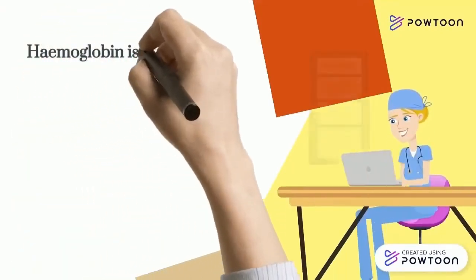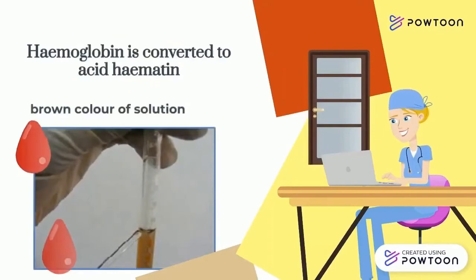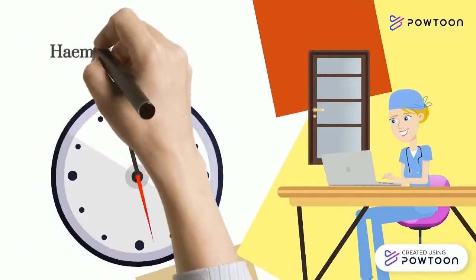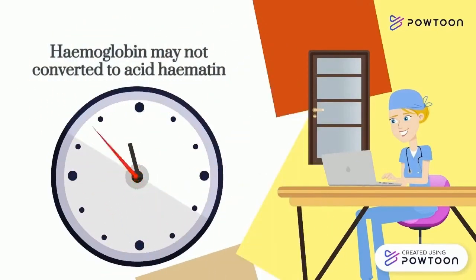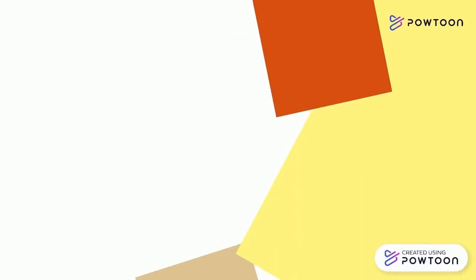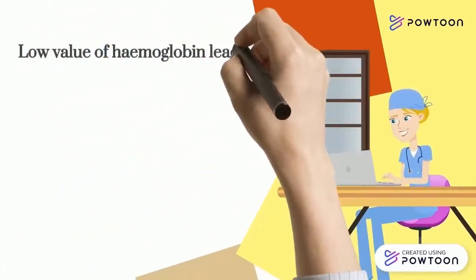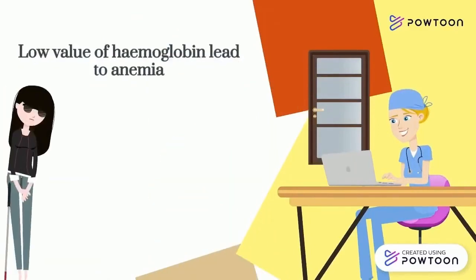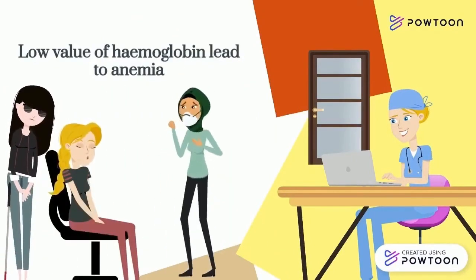When hydrochloric acid was mixed with the blood in the hemoglobinometer tube, hemoglobin is converted to acid hematin, which looks brown in color. If less time is taken, it may not be enough to convert all the hemoglobin to acid hematin. And this will indicate a low hemoglobin result, which leads to anemia, and that causes symptoms like fatigue and trouble breathing.